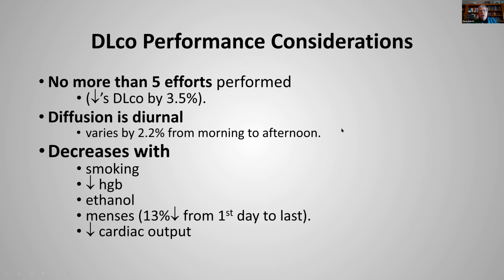Okay, what are some of the things you need to consider when you perform diffusion? You don't want to do more than 5 efforts, because once you get above that, your diffusion starts dropping by 3.5% every effort because of the retention of that tracer gas, carbon monoxide. Diffusion is diurnal. It varies by 2.2% from morning to afternoon. And that's why it's recommended the repeat test should be done at the same time of the day.